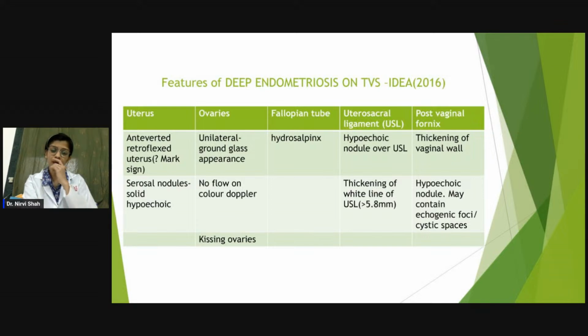Also, if there are adhesions in the POD and posterior compartment, then both the ovaries are stuck behind the uterus, known as kissing ovaries.